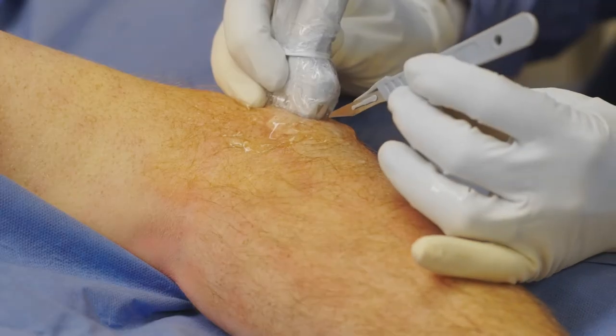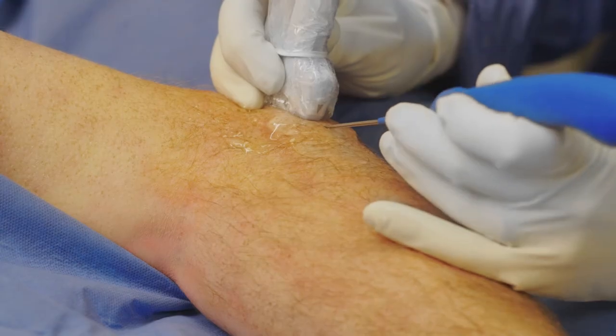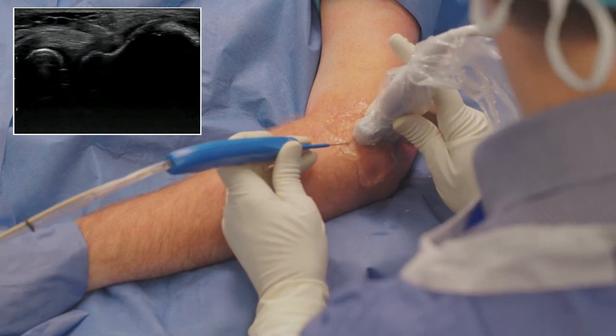Using an 11-blade scalpel, I make a small stab incision to create a pathway for the TenJet device. Once I have created a pathway, I guide the TenJet device towards the pathology while visualizing it under ultrasound.